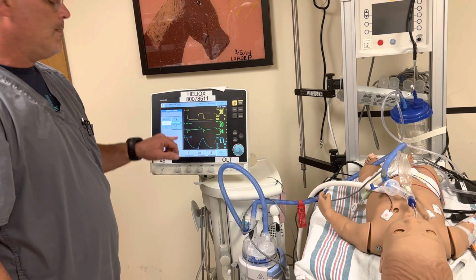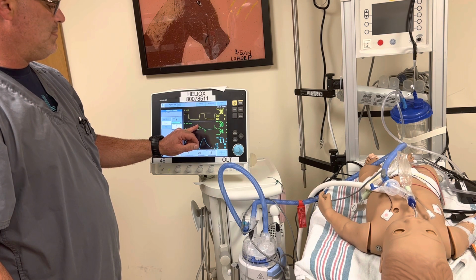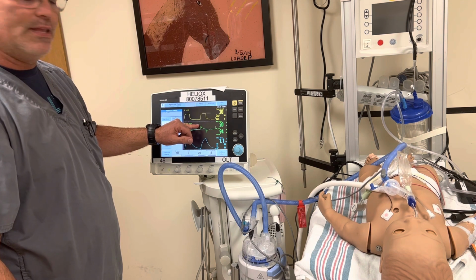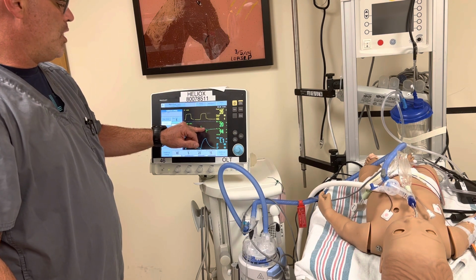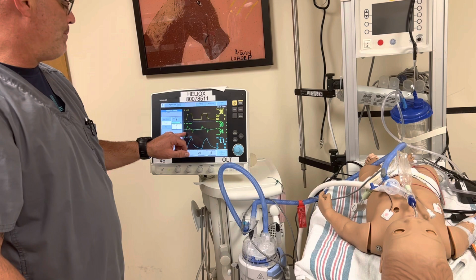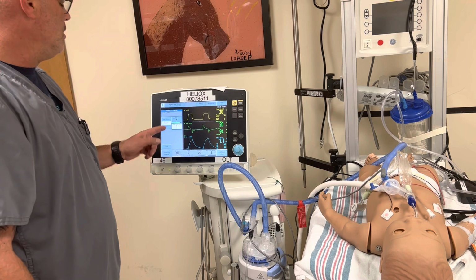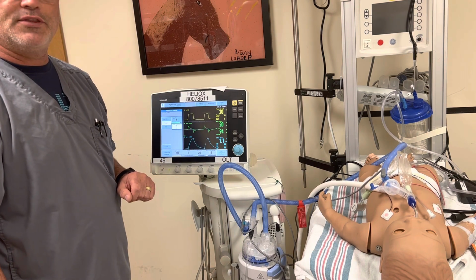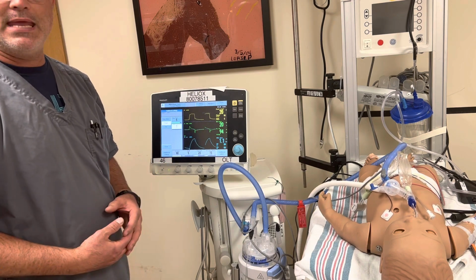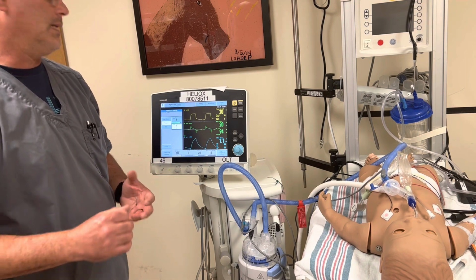The percent cycle, basically on a pressure support breath, each time it cycles in, it measures the peak inspiratory flow that occurred on that breath, which would be right here at the top of this, and then it waits until that flow slows down to 1% of that peak. So if that pressure support breath had a 100 liters per minute peak inspiratory flow, this 1 would mean the inspiratory flow from the servo would have to slow down to 1 liter per minute. And when that occurs, the patient is then able to exhale, and the vent cycles to expiration.